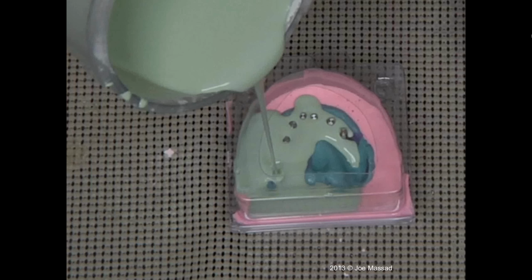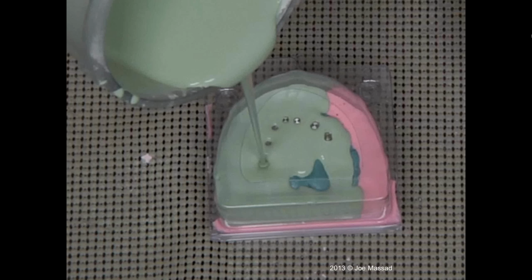It's liquid. Now, I want to make a point here that's important to make sure that we have it sealed, because these containers don't have any type of locking mechanism for keeping out any liquid.